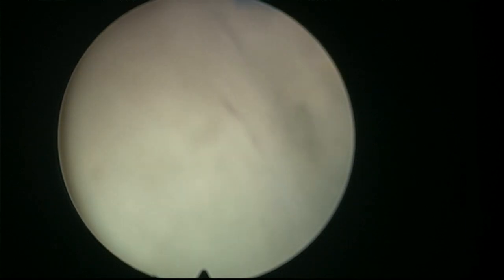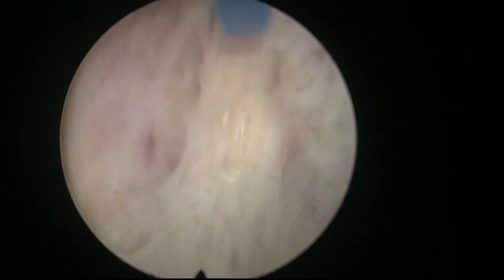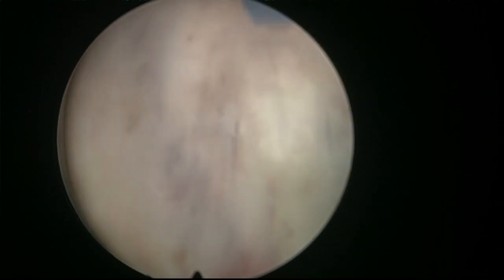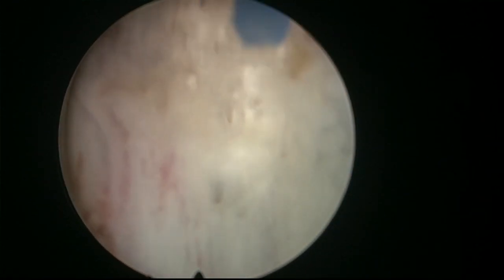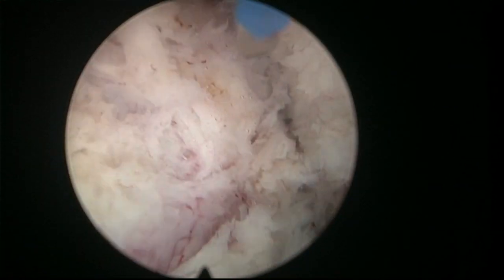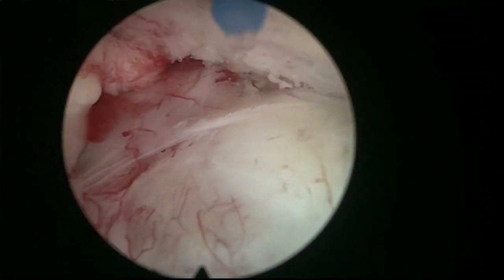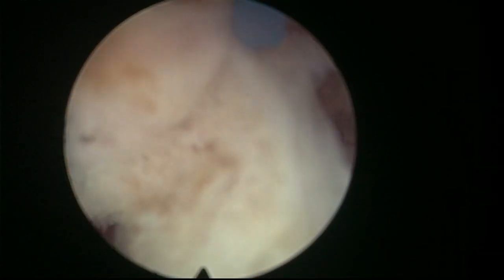So here we're coming up. I try to look at the direction of the fibers here, you see, because that gives you the clue of where the plane is going. Sometimes we decide what to do based on tiny anatomical details that you have to be searching for and looking for. Of course, you develop this understanding of the anatomy with some experience. There we are. So for the moment, we released a big part of the adenoma coming towards 12 o'clock. This is 12 o'clock fibers. Maybe we can complete the cut here.